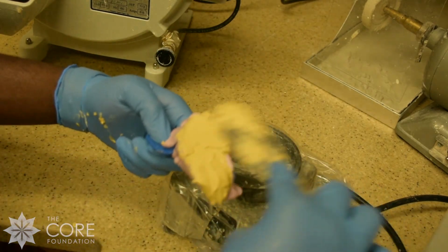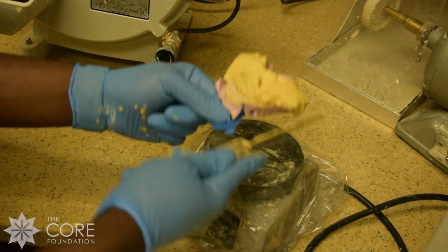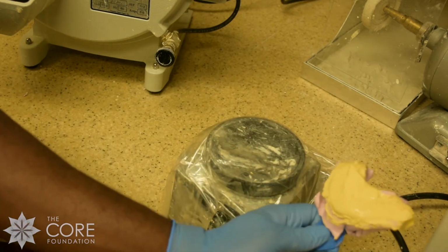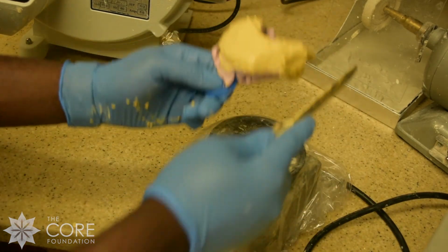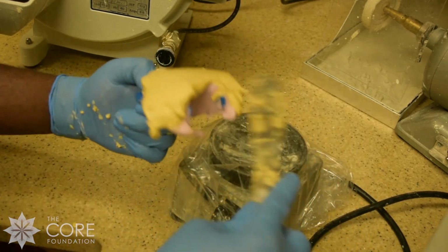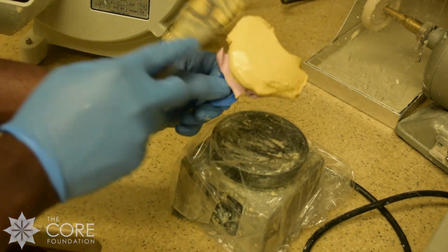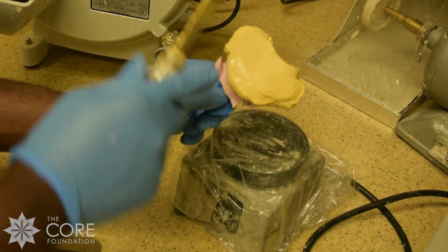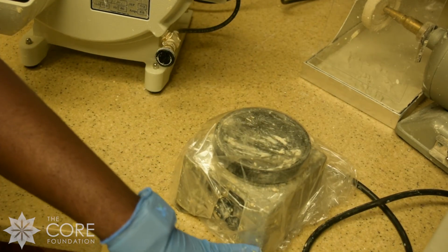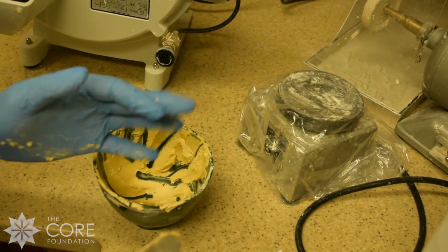Once I have everything covered, I'll put it back on the shaker just to make sure the new stone that I added incorporates really well with everything. Then once again, we have a really nice smooth base. Okay, so we're just going to place it down and wait for them to set. We'll turn off our shaker and then wipe it down and clean it really well.